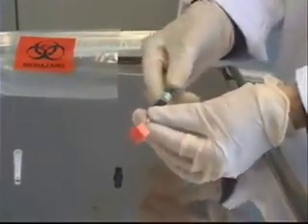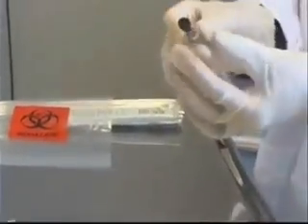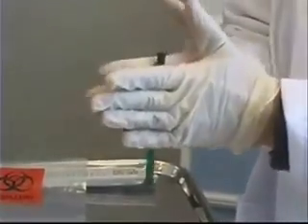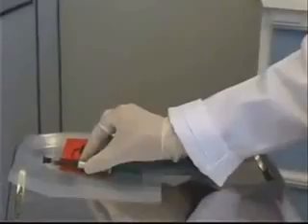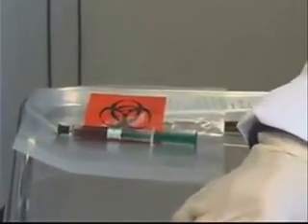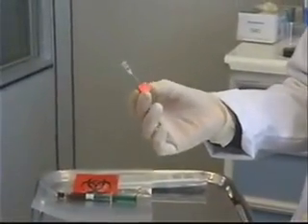I can now remove the cube and needle as one, and attach the black cap to the tip of my syringe. I can give it a roll to make sure that the heparin has dissolved, and then place it into the bag of ice to send off to the lab. My last step is to dispose of the needle and cube in the proper sharps container.